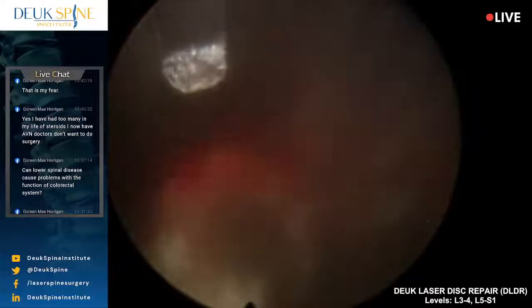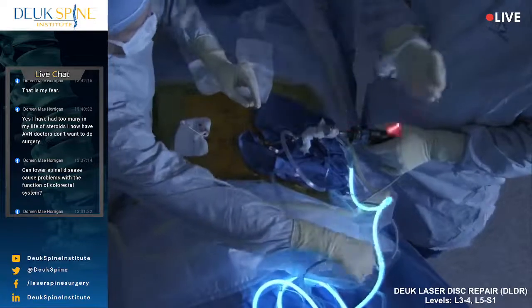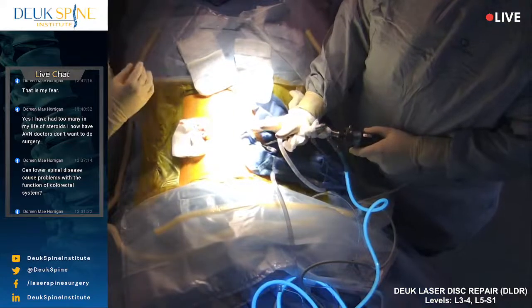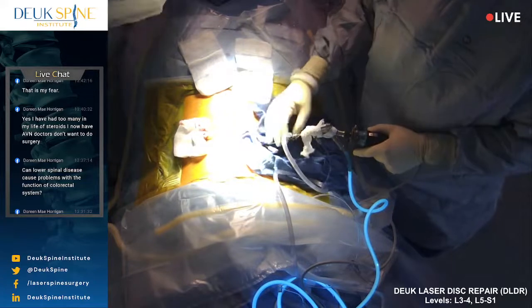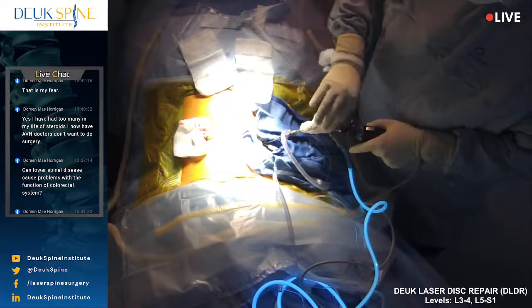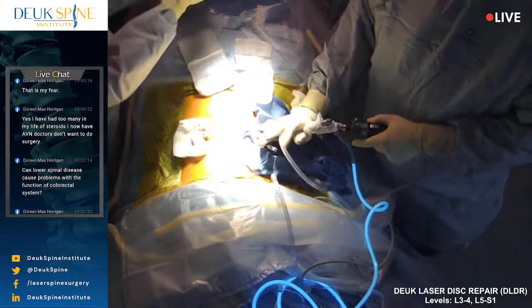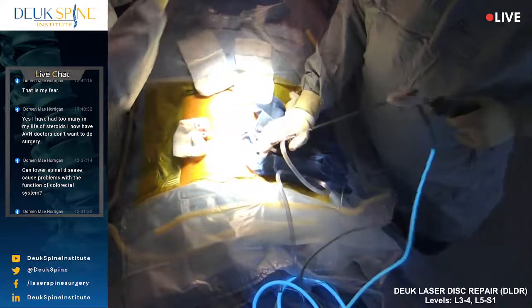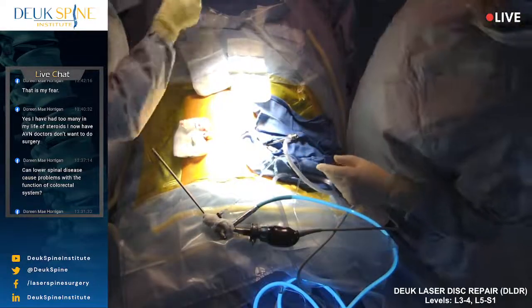All right, we're done on this side. Scope, laser out. I don't know. Did I answer the question, Diego? Yeah, she says that what you predicted is her biggest fear. All right. So we're going to do a little antiseptic.